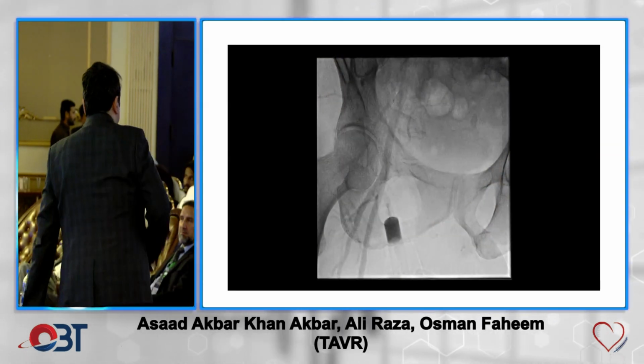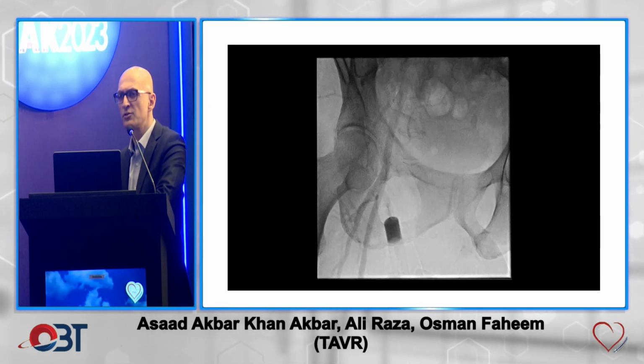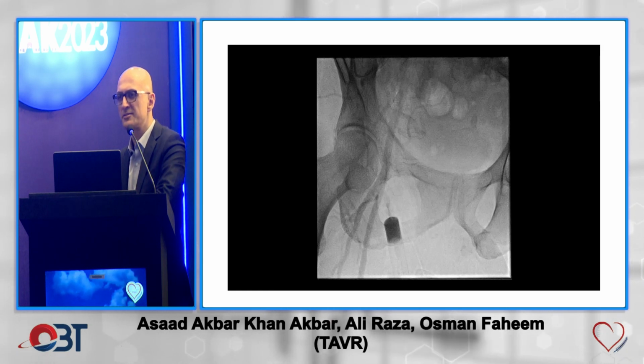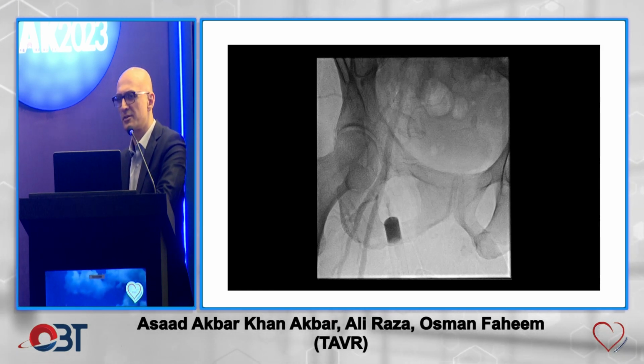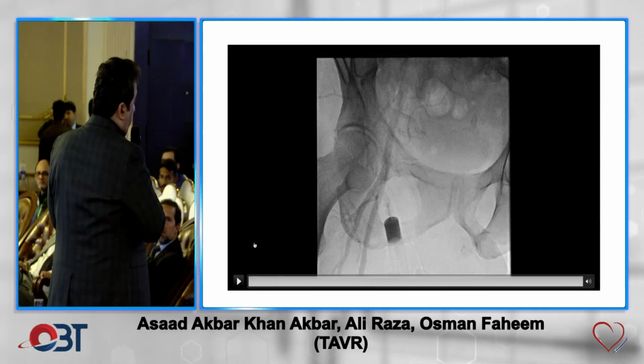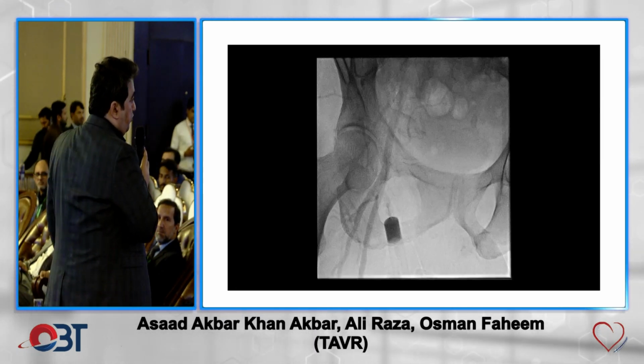Agreed, isn't it? Not just for TAVR, but for everything. It's good to have that, because you will run into cases where the access is difficult, and then if you're facile with ultrasound, it is very helpful. For trainees, I would say that take all your femorals with ultrasound guidance if it's possible for you.